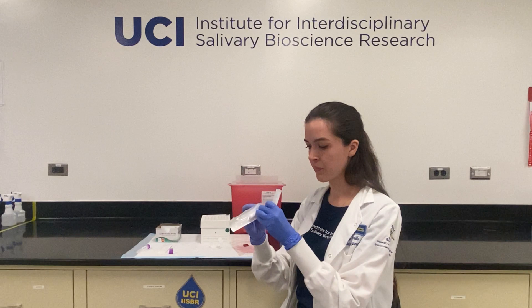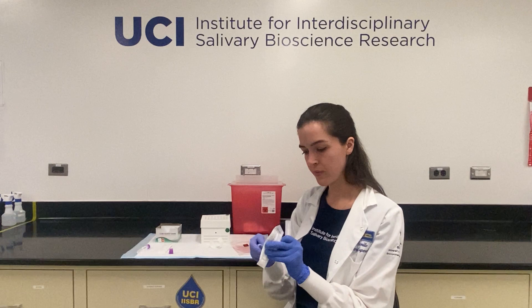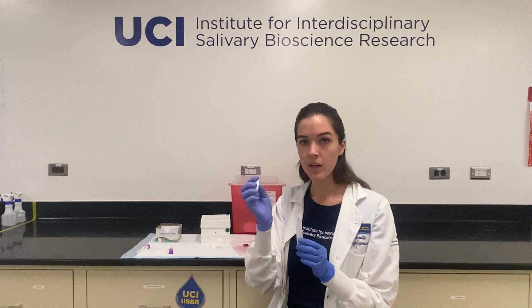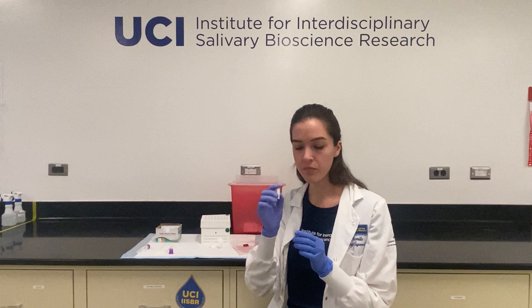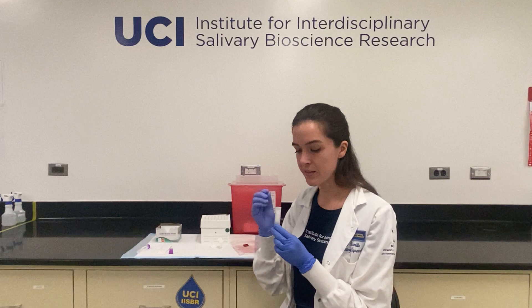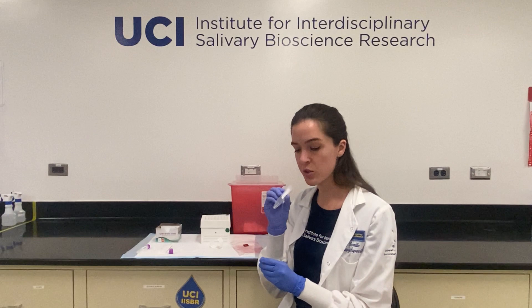You'll open up your swab and then place it underneath your tongue. Your study instructions should tell you how long to keep it underneath your tongue. You should be careful not to bite or chew on the swab as this could affect how much your swab can absorb. After enough time has elapsed, you'll want to either with clean hands take your swab and put it into the basket of the tube, or using your tongue gently guide the swab from underneath your tongue into the tube.